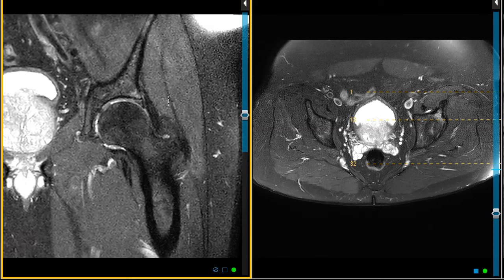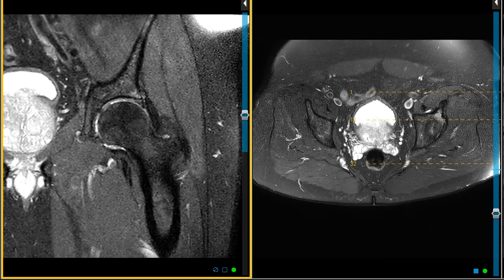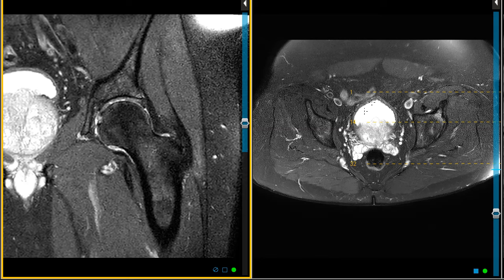Sometimes cartilage that lines the joint can go up underneath the labrum and look very similar to this. So in cases like this we're not sure — the orthopedic surgeon may go to a scope, or we'll fill up with contrast and do an arthrogram to see, with the joint distended, if contrast goes into a small tear. Labral tears can be very difficult, but that's not the main reason I'm showing this case.